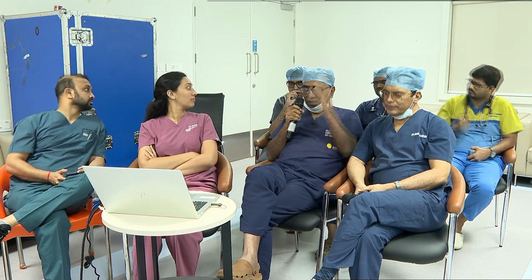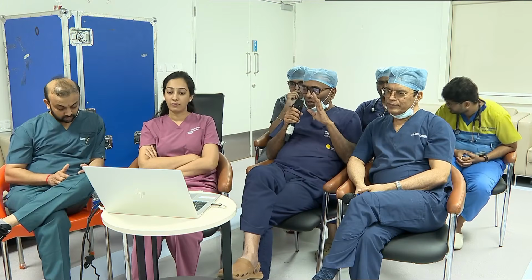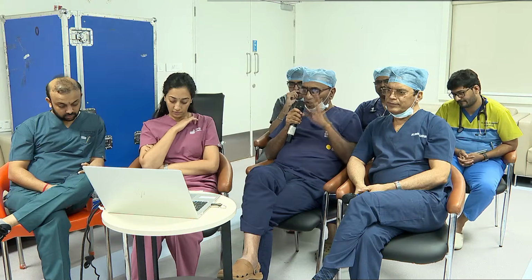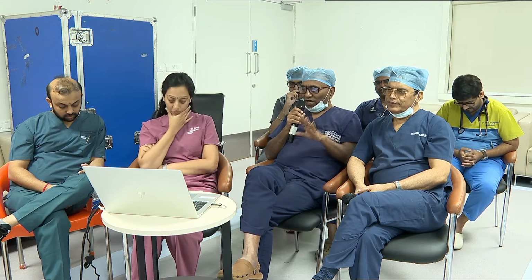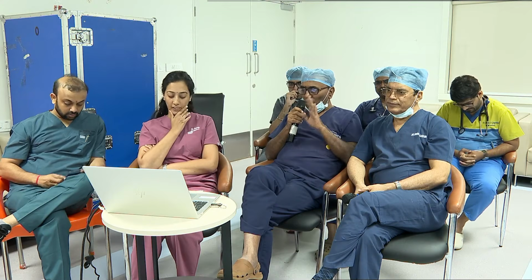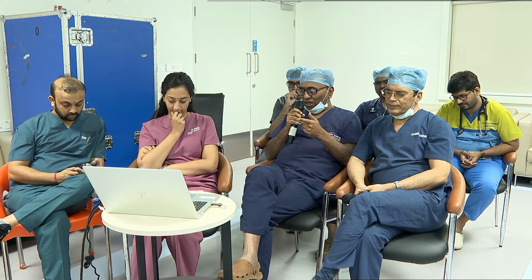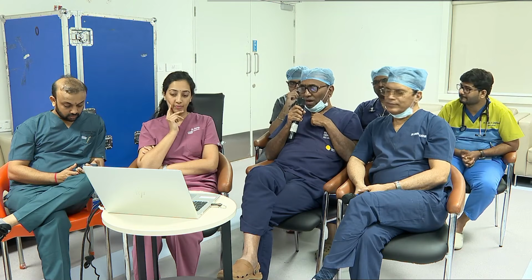I will ask our panelist, Dr. Aparanji, one question, and Dr. Rajaram and others. American Heart Association says TAVR above 65. European Society says TAVR above 70. In India, which guidelines would you like to follow, AHA or ESC? Your valuable opinion, Dr. Aparanji, Rajaram and others.